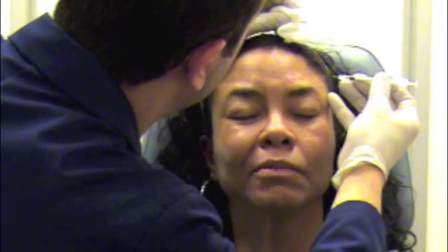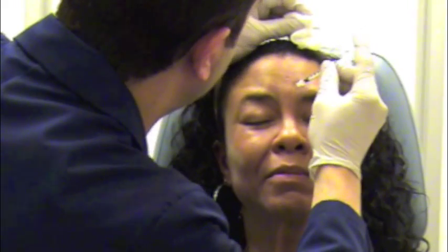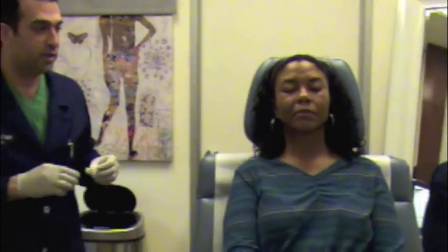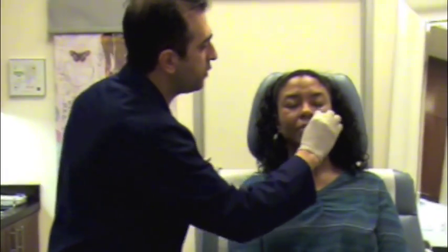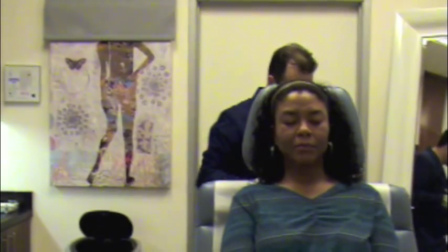Raise your eyebrows. Good. Excellent. 1 more pinch here. Excellent. So that's going to take care of that. Obviously, the medicine doesn't work instantaneously, so we're going to need about a few days before that works. And we're going to concentrate in this area. I'm going to bring your chair up.